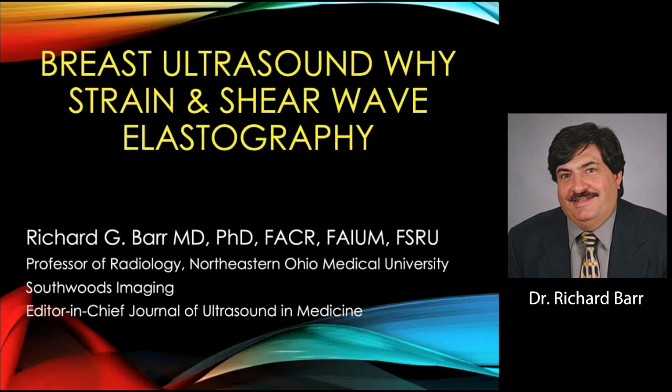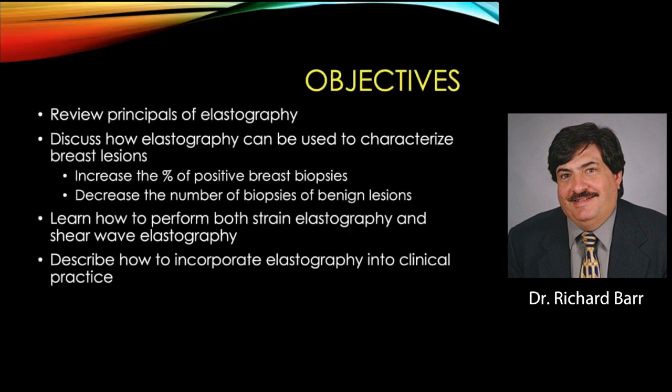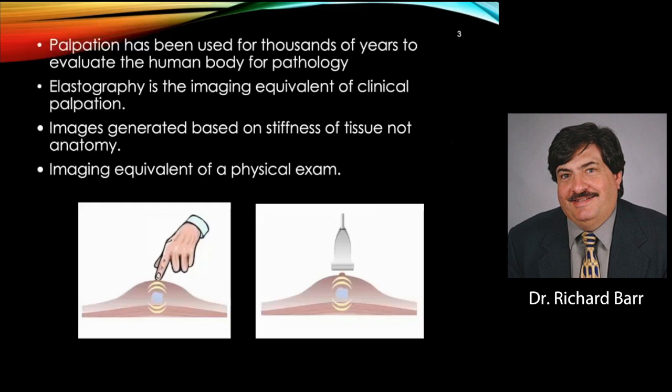Today what I'd like to do is go over breast ultrasound, and why strain and shearwave elastography is important for your practice. The objectives are to review the principles of elastography, discuss how elastography can be used to characterize breast masses, and in doing so, increase the number of positive breast biopsies and decrease the number of biopsies of negative lesions. Learn how to perform both strain and shearwave elastography, and to describe how to incorporate elastography into your clinical practice.